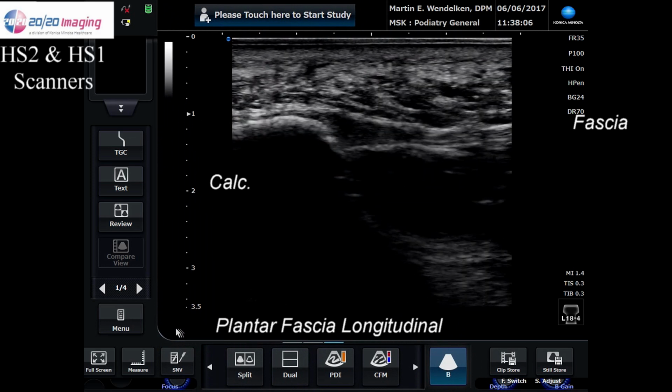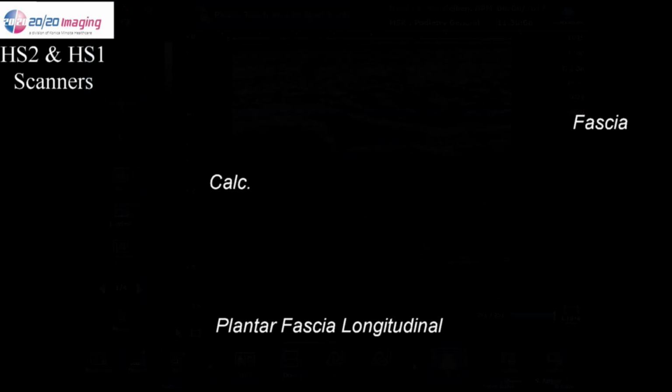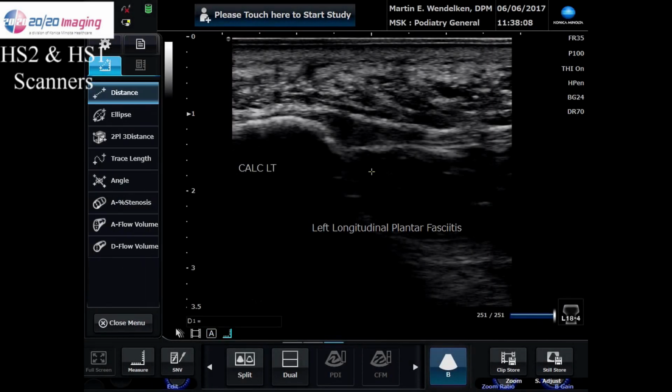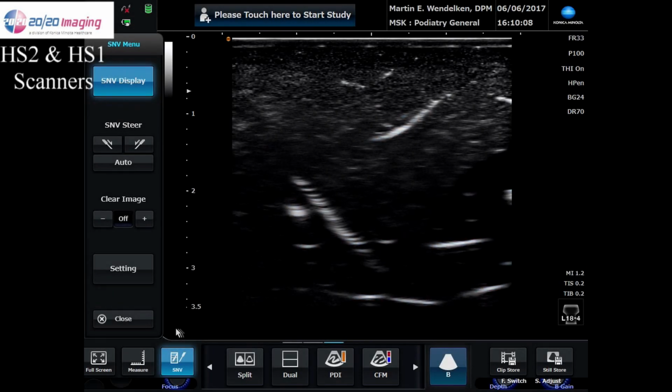Let's now freeze the image, and we're going to measure the thickness of the plantar fascia. I begin now by hitting the measurement button, and there you'll see the measurement menu. I click on the inferior surface. I go to the superior surface. Remember, this is inverted. The plantar fascia is inverted, and you can measure it at 4.6 millimeters.